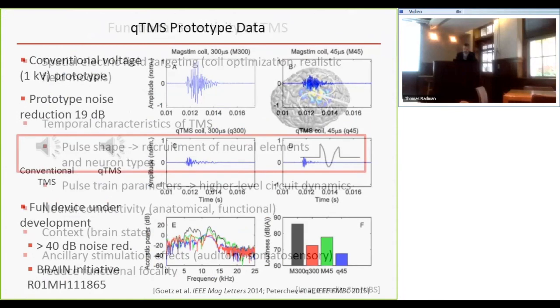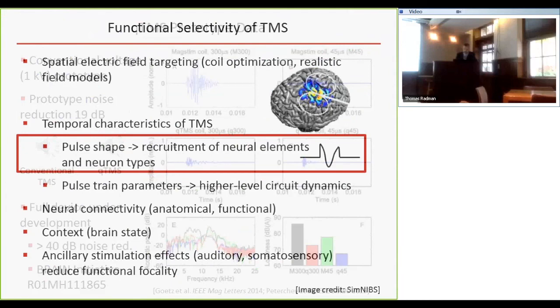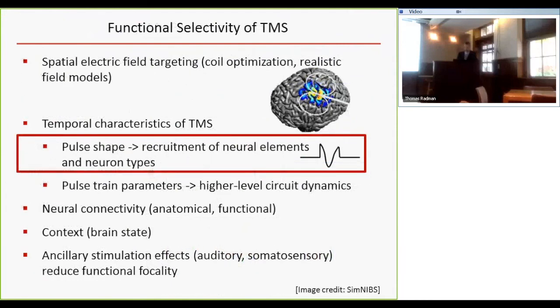Now I'm moving on to the last component of the presentation, which is the most extensive. The previous two were basically previews of this technology that's in development, to whet your appetite. I'm going to share results that are closer to publication, or already published, that have to do with how we can leverage and understand the effects of pulse waveforms in TMS on neurostimulation.